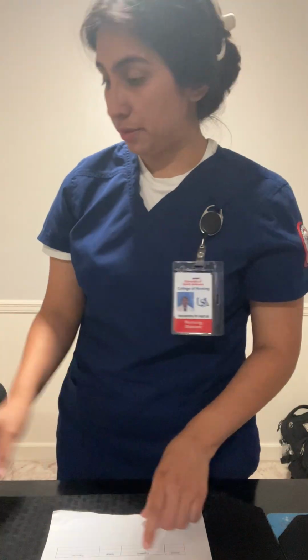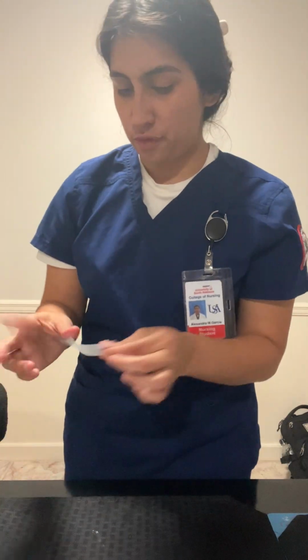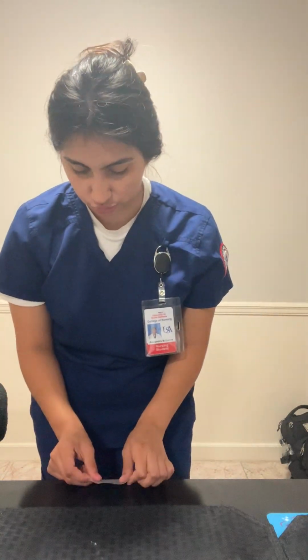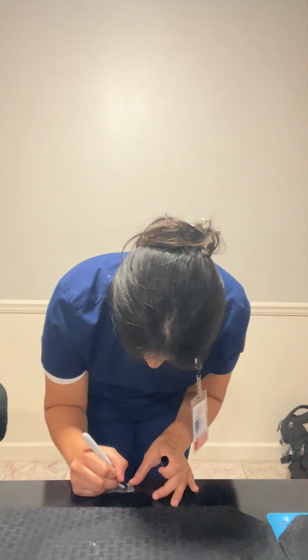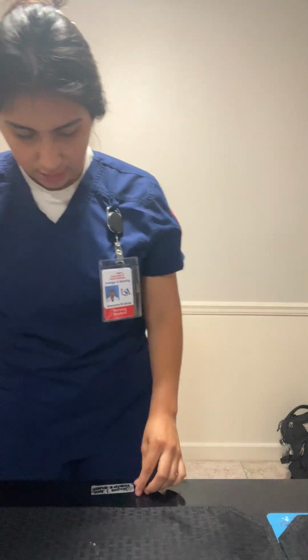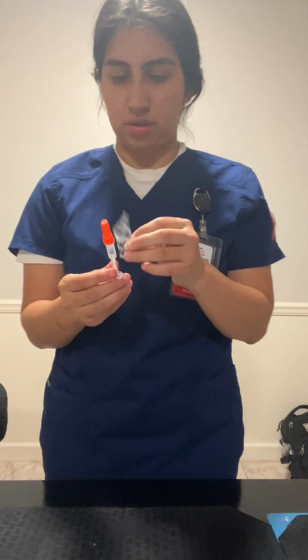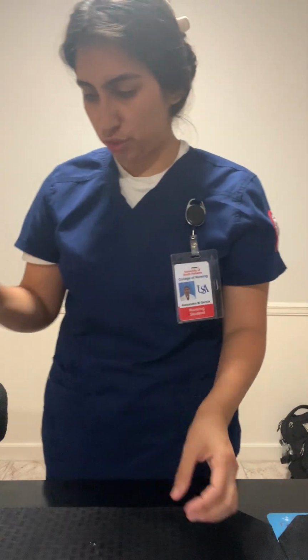And then I'm going to label my syringe and put the dosage, drug, and the patient's name: Jaguar J. Jones, Novolin R, 10 units. Okay, so I can bring this to the patient's room.